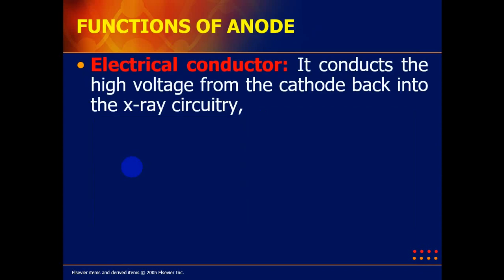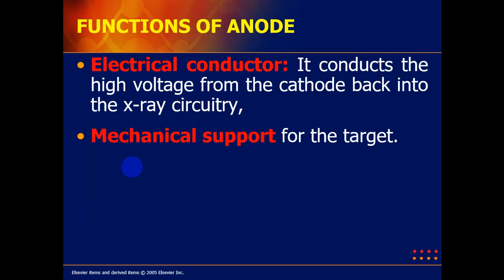Ito yung functions of the anode. First is electrical conductor. It conducts the high voltage from cathode back to the X-ray circuitry. Second is for mechanical support for the target. Kasi walang paglalagyan ang target.